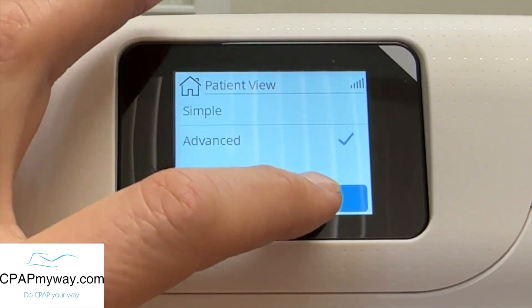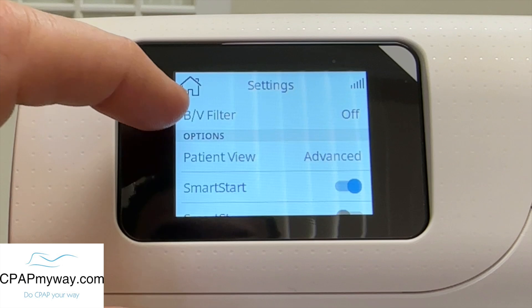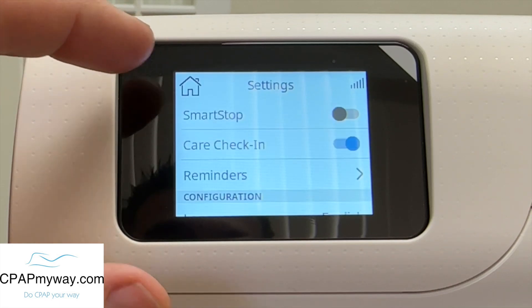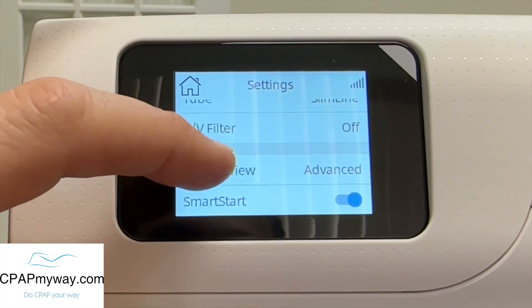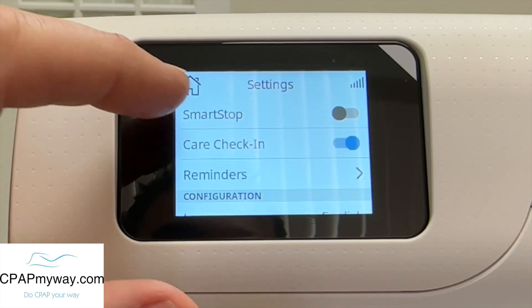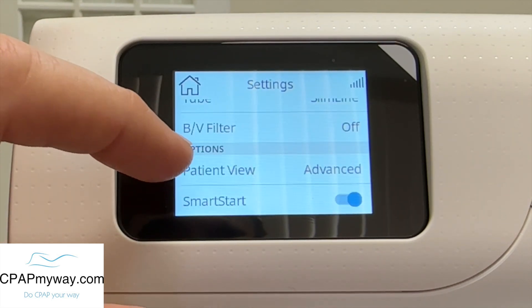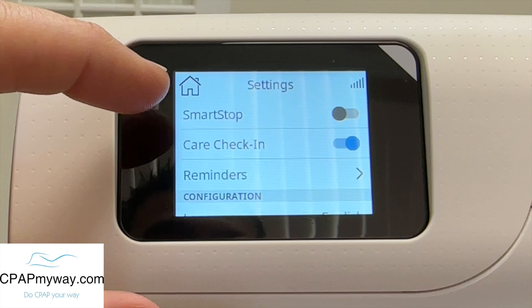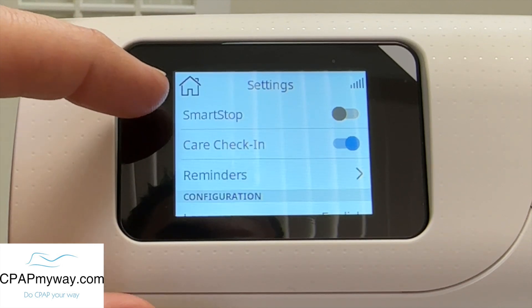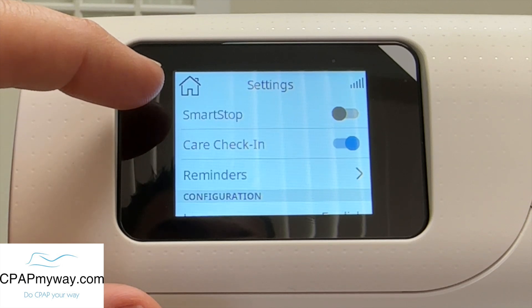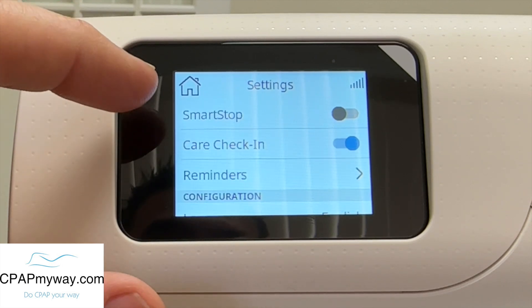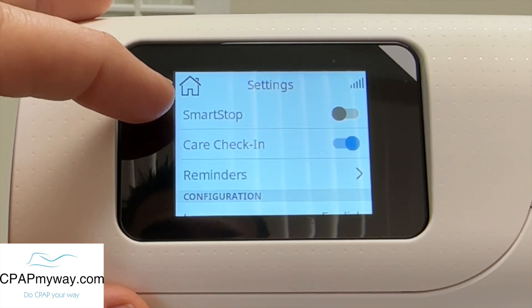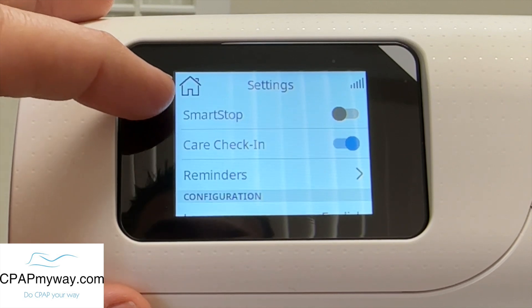I always change the patient view to advanced because I like giving people the freedom to see as much information as possible. So if you switch it to advanced, they'll be able to see a lot more on their reporting on screen. Smart start and smart stop are obvious — smart start allows the machine to turn on by itself when it senses the breathing; smart stop tells the machine to turn off when it senses you stop breathing. I'm very cautious on these 11 devices on the smart stop — it's pretty darn sensitive. So if you get a big leak, I've heard of it accidentally shutting the machine down mid-therapy. Once it senses your breathing it kicks right back on, but it's a weird feeling that can happen in the middle of the night. So unless you really feel like you need the smart stop, I'd leave that turned off.